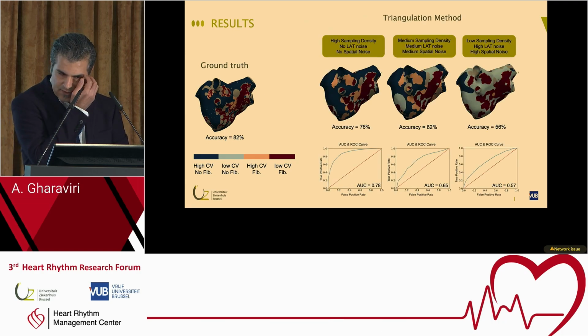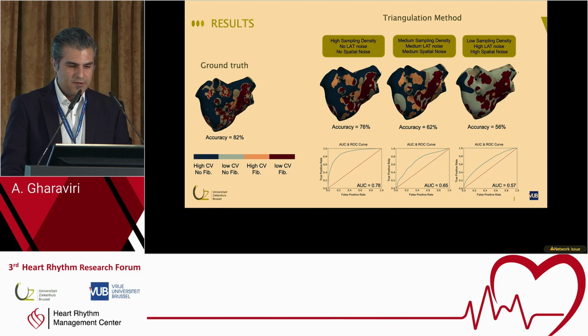What happens if you use the triangulation method? The triangulation method did a pretty fair job of identifying fibrotic regions when we have very high sampling density, no local activation time noise and no spatial noise.